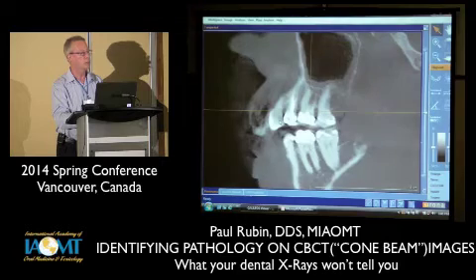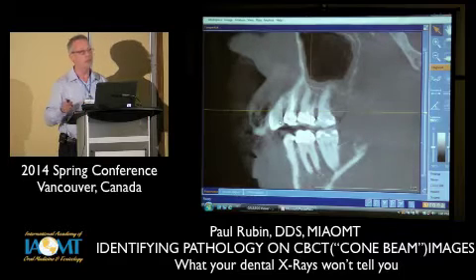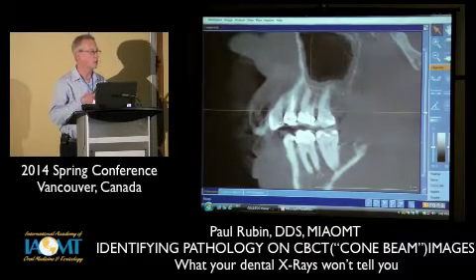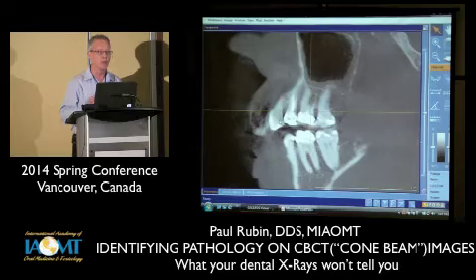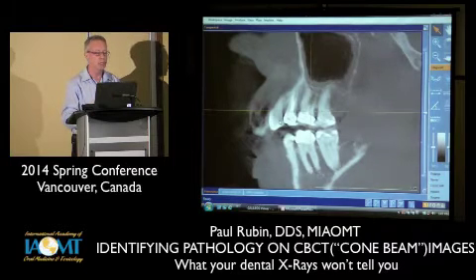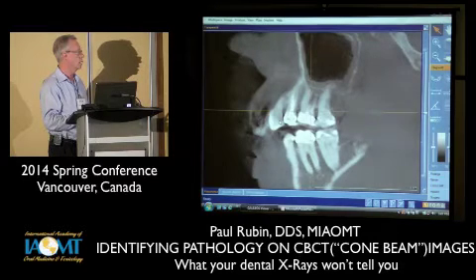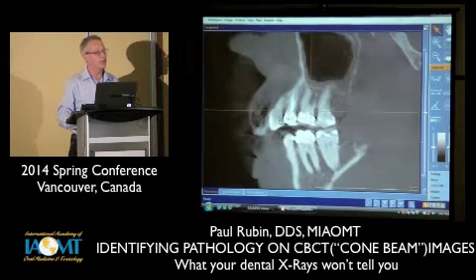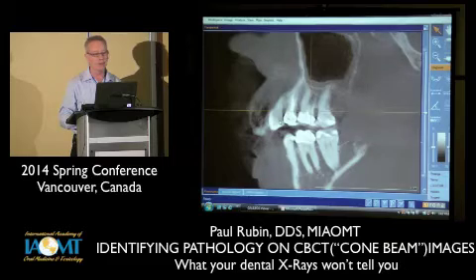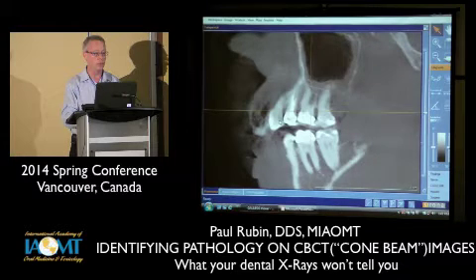I am amazed when we look at these films how many fail, and when I say failed root canal, I mean radiographically failing. As far as I'm concerned, all root canals are failures, but that's a whole other philosophical thing. But radiographically interpreting this, it's clearly radiographically failing. I know that some endodontists may look at this and say, oh, that's just a little bit of scarring. And again, this is not a radiographic interpretation, but a philosophic interpretation of that space, I would say. I don't consider that scarring. I consider that failure, and it's probably infected.